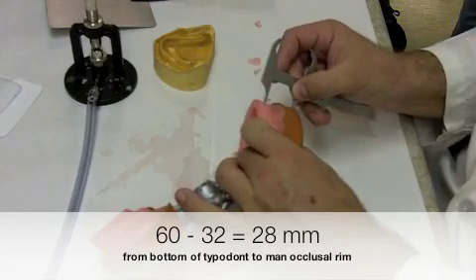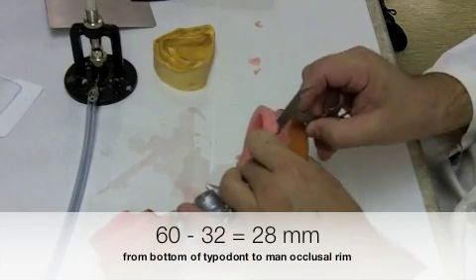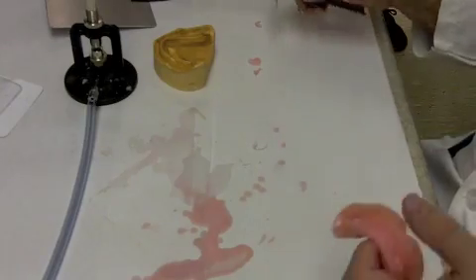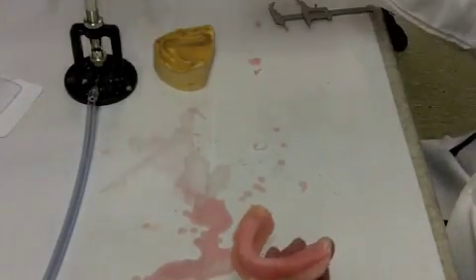So here I'm just taking the Boley gauge. Understand, in a patient we would first establish a vertical dimension of rest, then arbitrarily close that down a couple of millimeters to establish a tentative vertical dimension of occlusion. Then we would want to evaluate it, making sure that when the patient is at rest, the rims are not touching.